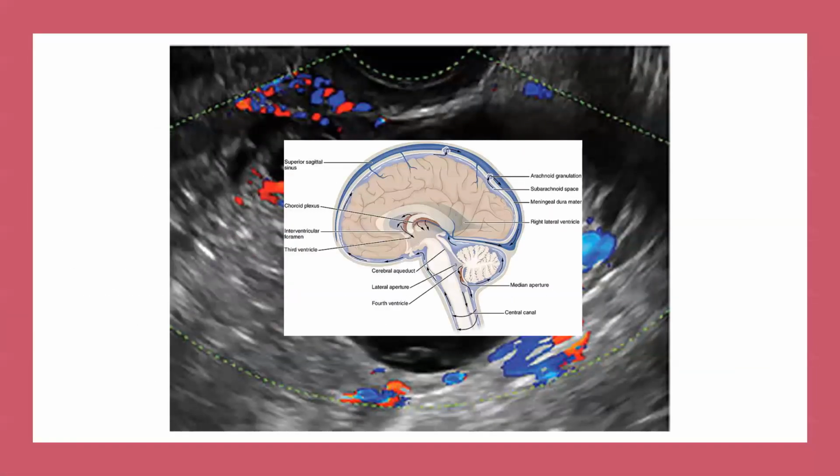Eventually, the gist of what we've discussed over the last 50 minutes is that you ideally use a curvilinear probe, which allows you to send sound waves into the brain and gives you maximum tissue exposure through the fontanelle. That interaction with the brain tissue helps to delineate very nicely, depending on the frequency you use, the meninges, the interhemispheric areas, the extraaxial space, then the superficial brain tissue and the sulcal gyral appearance, and gives a bright appearance to the corpus callosum. Naturally, it's tissue-based. There's a difference in acoustic impedance here and here.